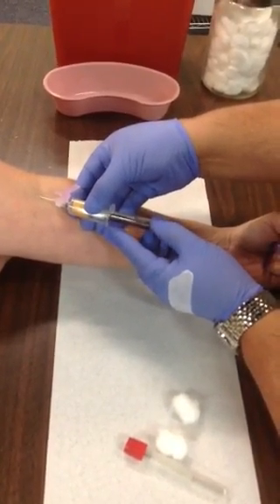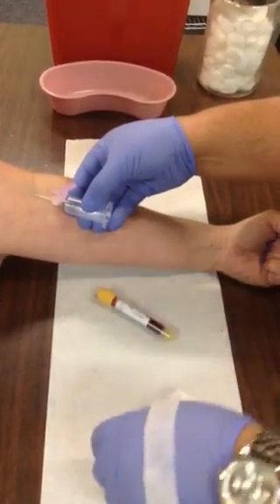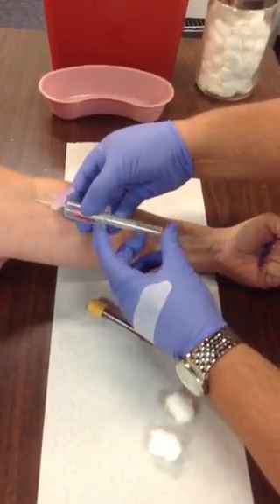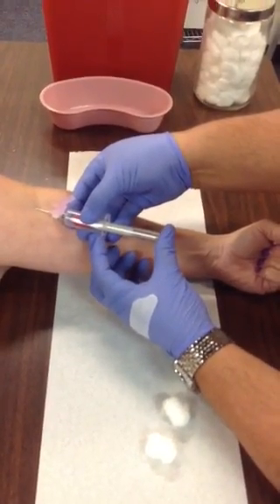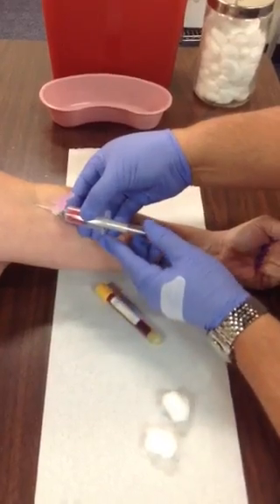Pull it out — notice how you're placing your fingers on the tube and the flange. Pop another one in using your thumb on the butt end of the tube and your index finger on the flange of the adapter, pop it in, and pull it out.